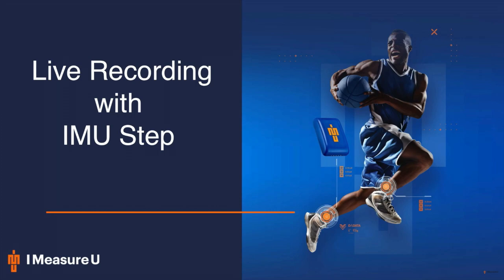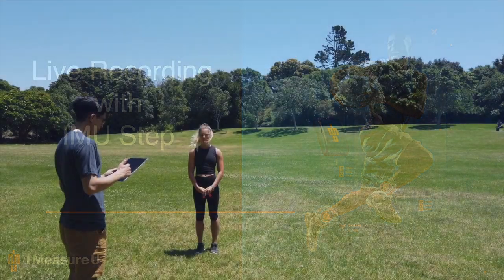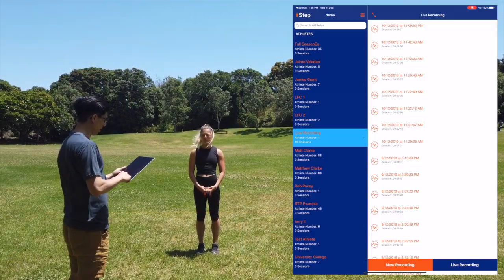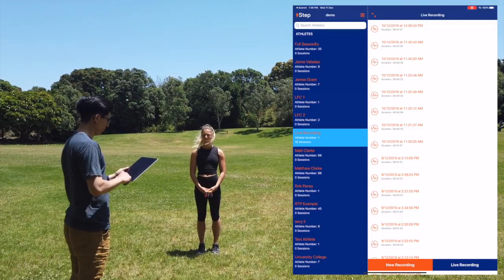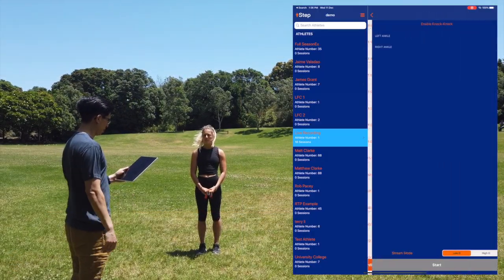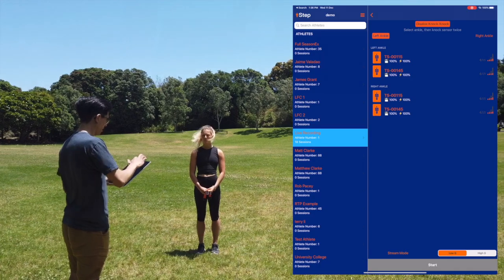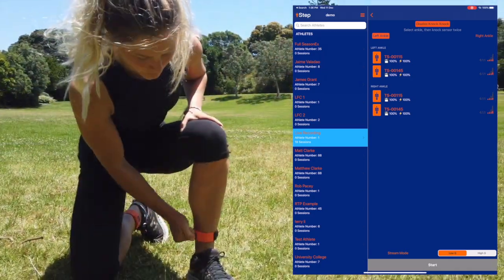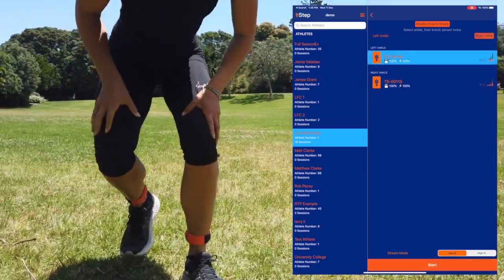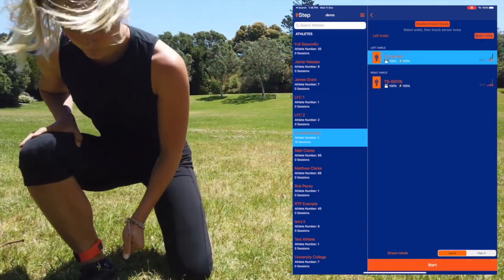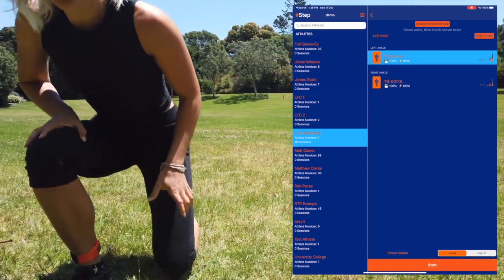To start a live recording, open the IMU-STEP app, select your athlete, and select Live Recording. With your sensors attached head forward, knock twice on each sensor to assign them to the left and right ankles.